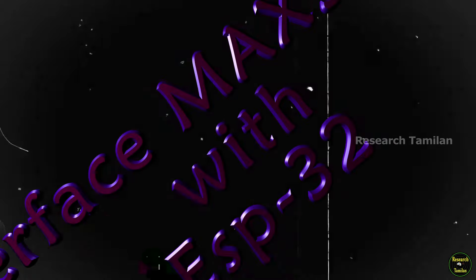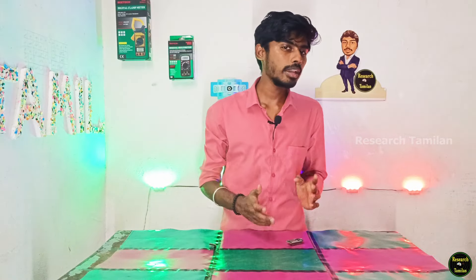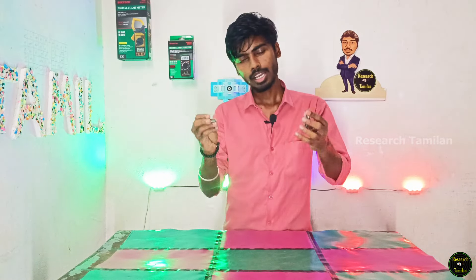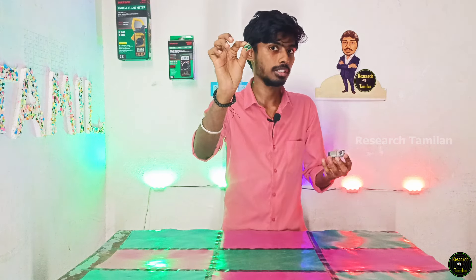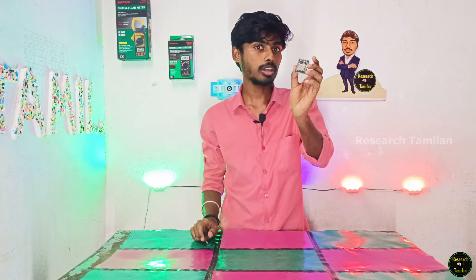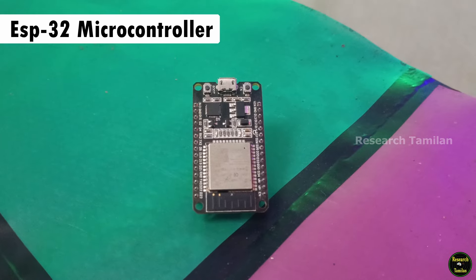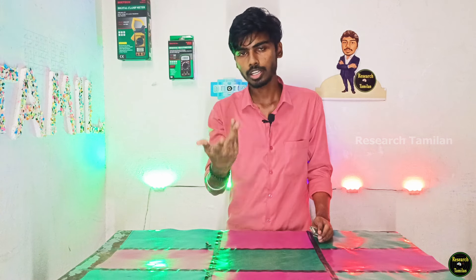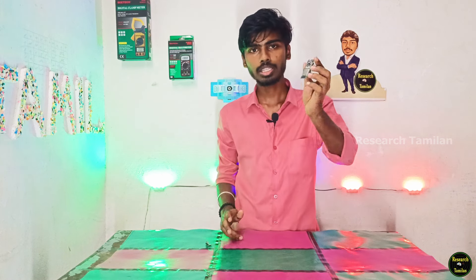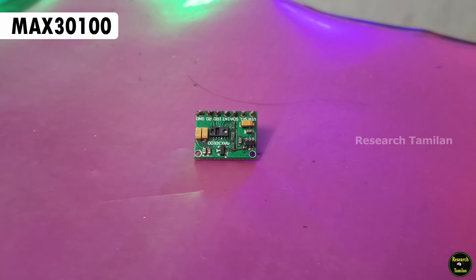Interfacing MAX30100 with ESP32 microcontroller. Friends, what components are we going to use? Just two components: one microcontroller and one sensor. We are going to use the ESP32 microcontroller. It has Wi-Fi, so we can easily use the Blynk app and interface. The next part is the sensor, which is a MAX30100.